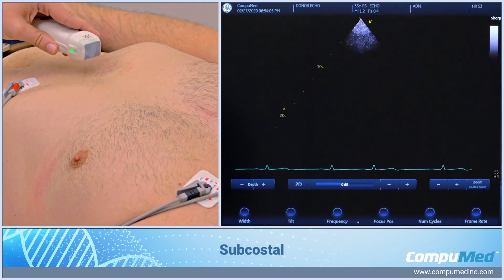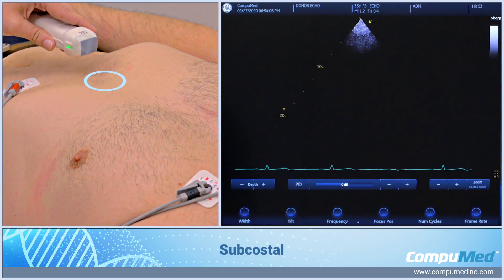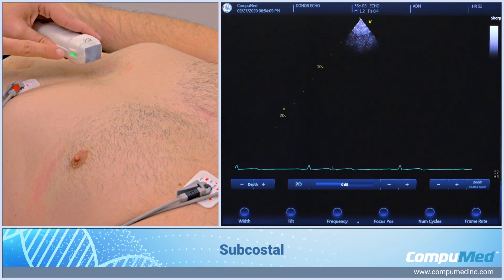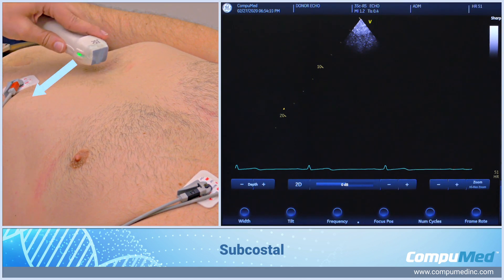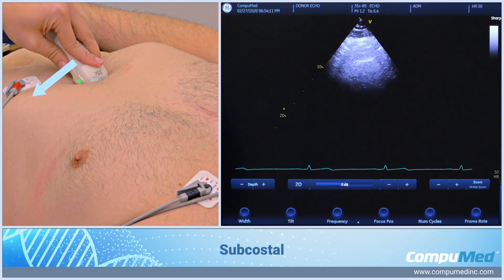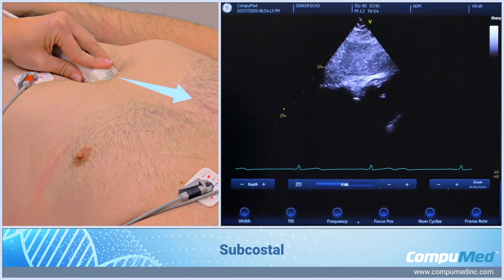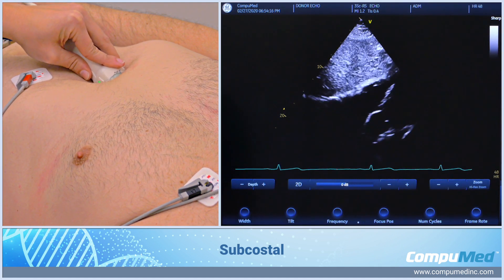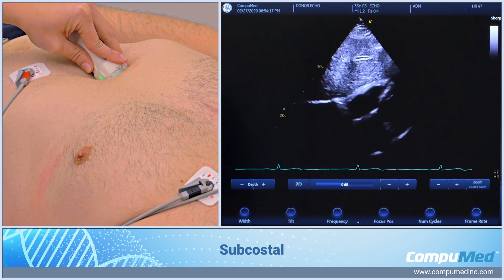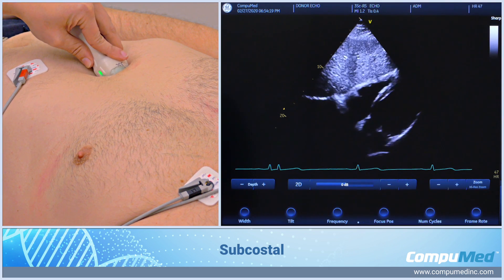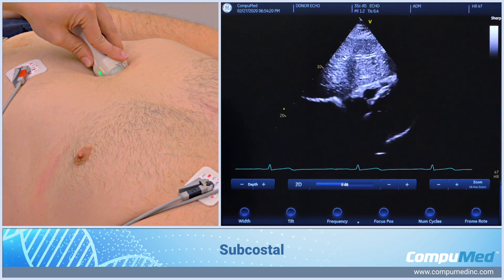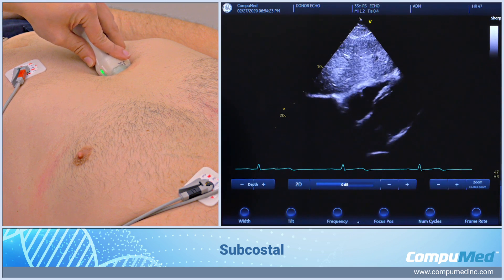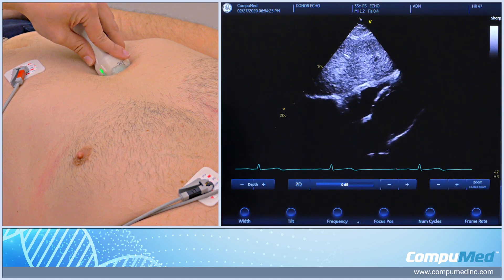For our subcostal view, we're going to go just below the patient's xiphoid process. Our index marker is going to be facing 3 o'clock, and you're just going to angle up. We have liver on top and a subcostal 4-chamber on our image.